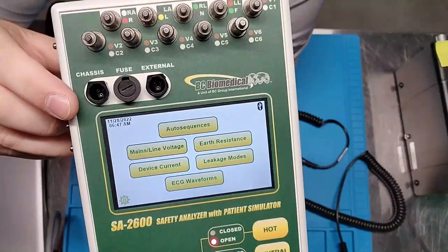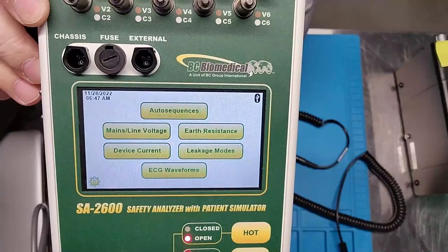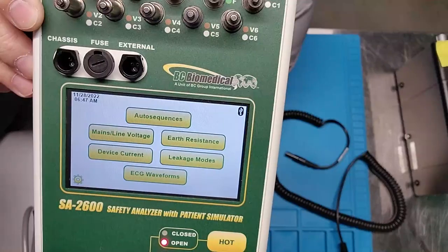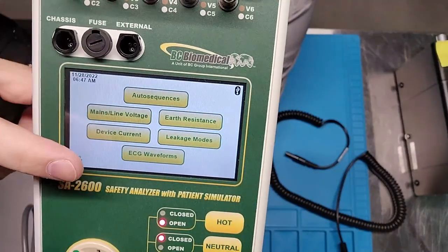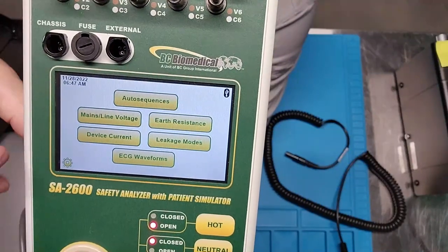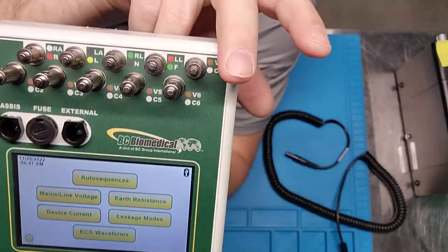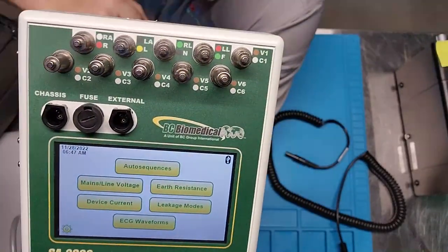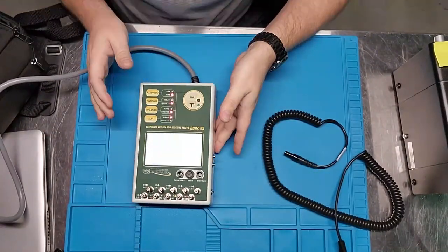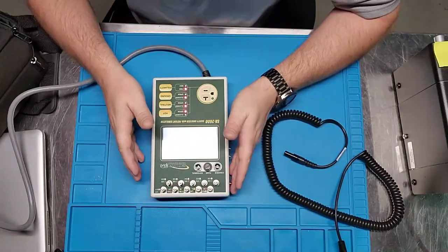Right here on the main screen we have auto sequence, earth resistance, leakage modes, mains voltage, and device current — I love that device current is right here on the main page of the touch screen. We also have ECG modes and settings down here. Notice up top that this unit is Bluetooth-enabled, because it interfaces with the BC Group app — I'll probably do a whole other video on that app.